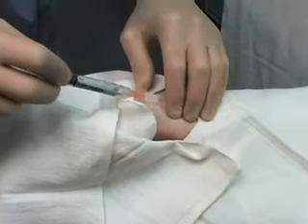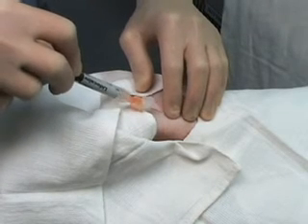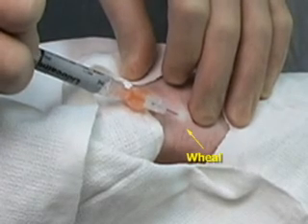Once positioned, the field can be sterilely prepared and draped using towels or a drape. As with all invasive procedures, meticulous care should be taken to minimize the risk of infection. After sterile preparation, a small wheal of 1% lidocaine can be infused in the conscious patient to help decrease pain associated with line placement.